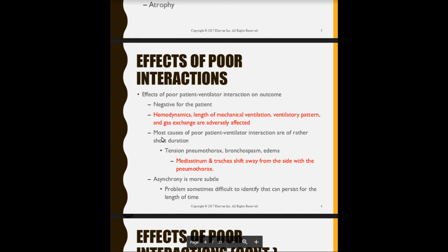So most of the time, you want to have a habit of looking at, if you're able to, and if your ventilator does it, the alarm log and seeing when the alarm triggered. Most of the time, you can trend and see, okay, around this time it's been happening, how long it has been happening, and what the frequency is. If it's alarming every 5 minutes for the past 3 days, that's something to look into.